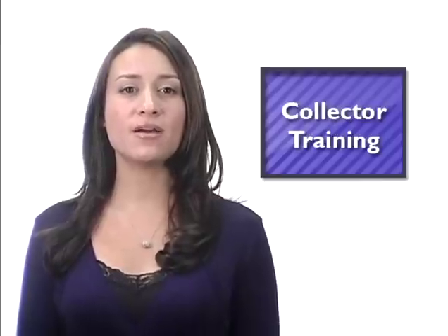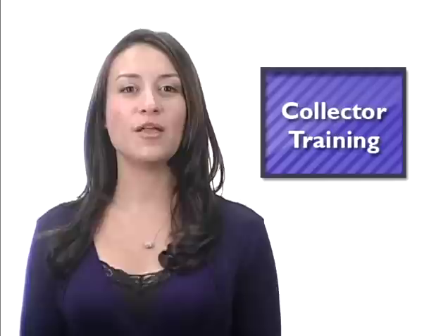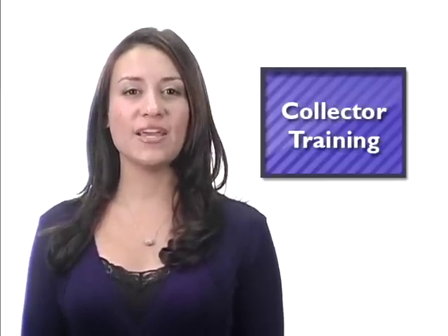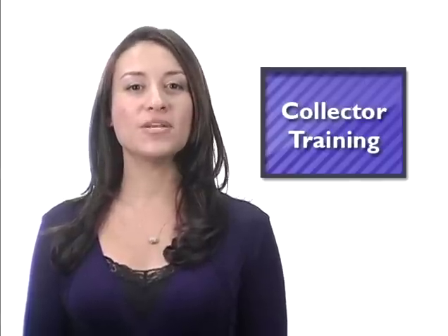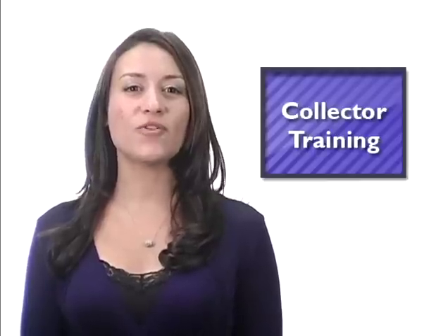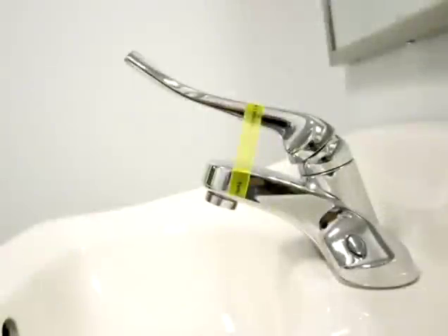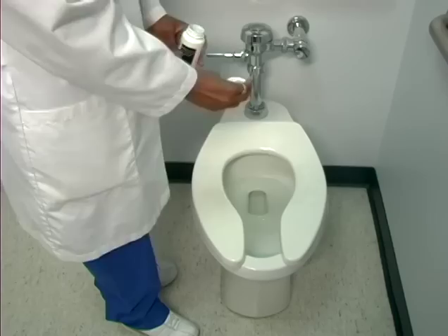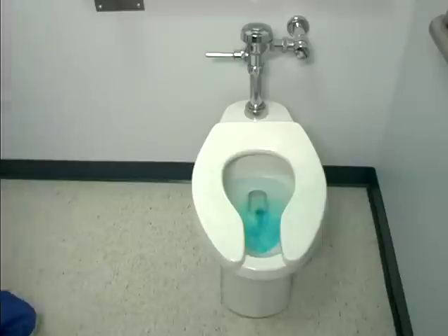We will start by discussing what the collector must do to secure the collection site before a collection can begin. The following 8 steps, which were discussed in the facility requirements section of this training, must be taken to prevent unauthorized access and to deter specimen tampering. First, secure all water sources by turning off the water inlet and/or securing all faucet handles with tamper-evident tape. Blue the toilet water to deter the donor from using the water to tamper with the specimen.